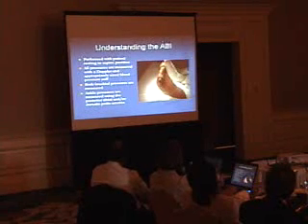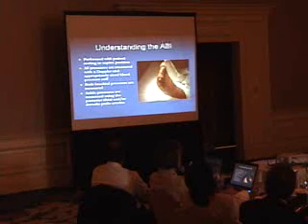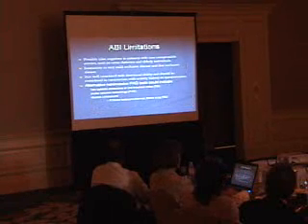So it's performed with the patient resting. All pressures are measured with the Doppler, and that's a handheld Doppler. Both pressures are measured, and we use both the dorsalis pedis and the posterior tibial arteries. And this is just an example showing the calculation. And like I mentioned, anything less than 0.9 is diagnostic of PAD.